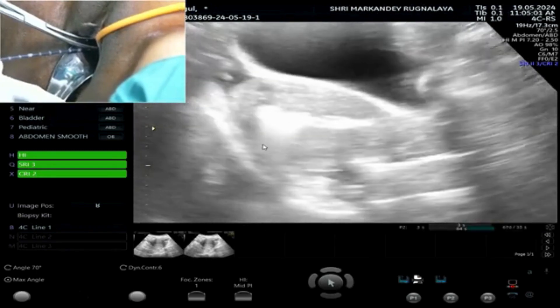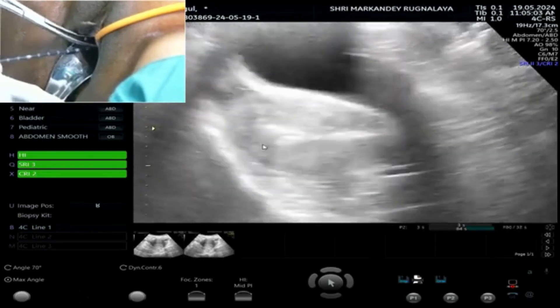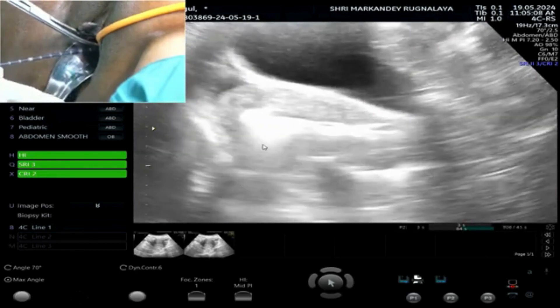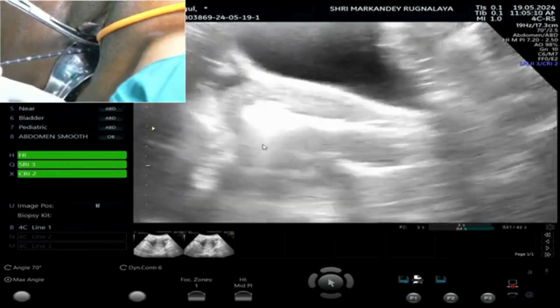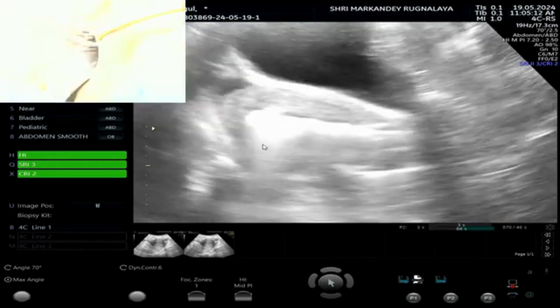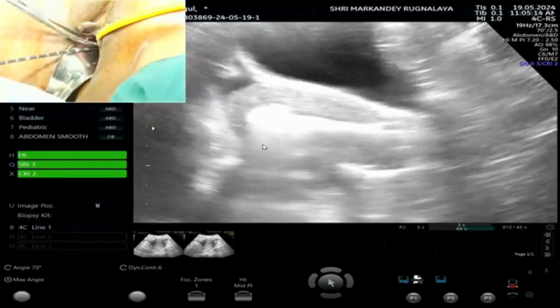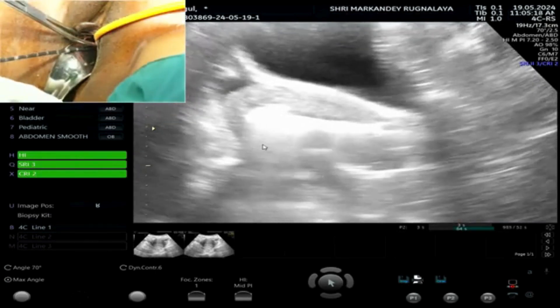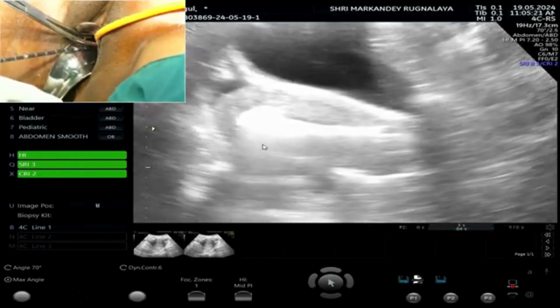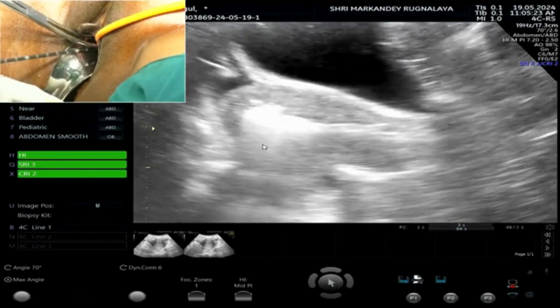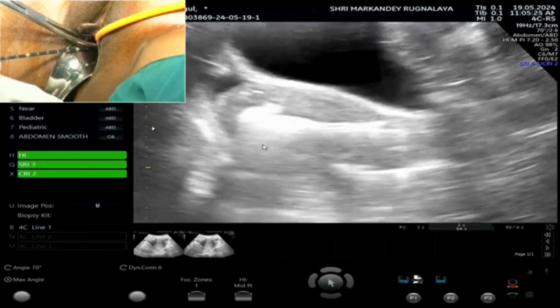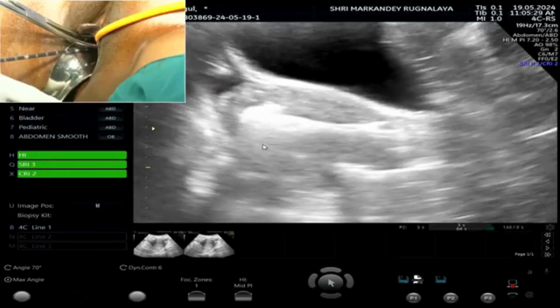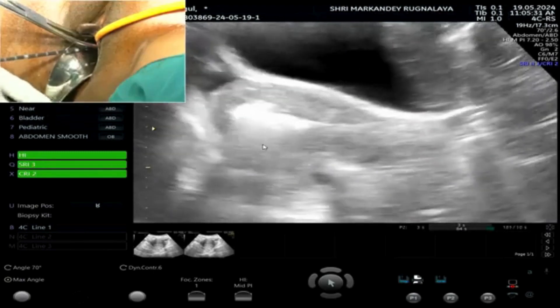Is there any bleeding coming from the cervical canal? It won't come because already we are coagulating inside. You can see I am using short movement technique because it sticks sometimes. You can check the movement also. Reduce some gain on the ultrasonography machine so we can clearly see. Once you have ablated, ultrasound also becomes blind sometimes — the trace cannot pass through the ablated dead area.